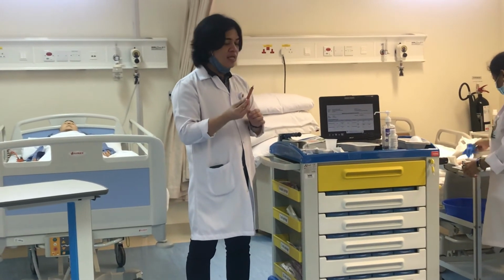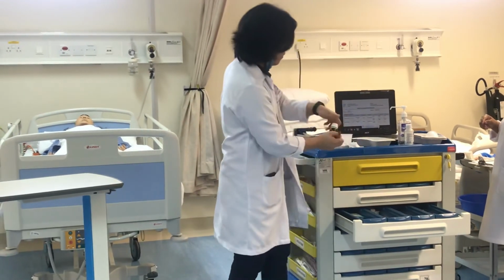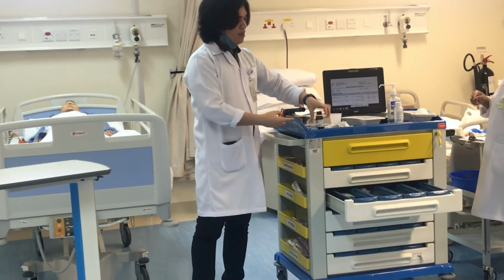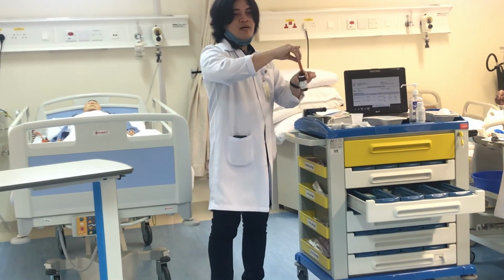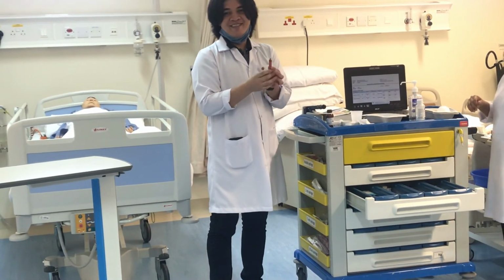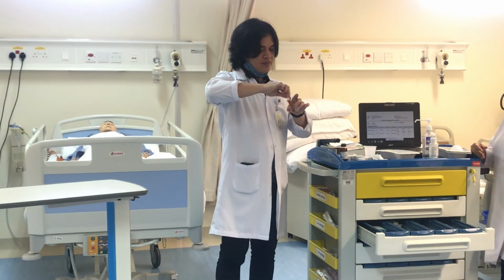But we never take the medication directly using the syringe from the medication bottle itself. It's wrong. We never do this. This is wrong. Still, we pour it in the medication cup and we aspirate it from there. This is wrong. It will contaminate the entire bottle. It's sterile already, but when you open this one, you might touch this one. That's why this will be safe. You just pour it here and then aspirate. We pour an approximate amount.